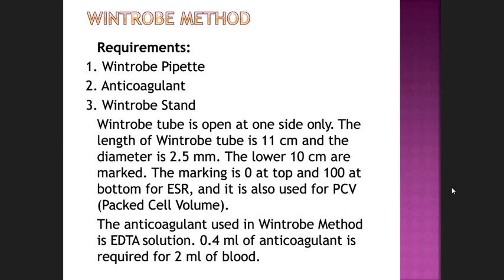Also, Dr. Manish, please also tell them the ratio. What is the ratio of blood to anticoagulant to use? That is also important in the practical exam.